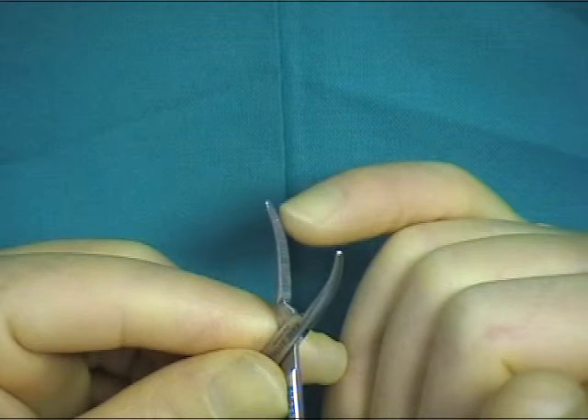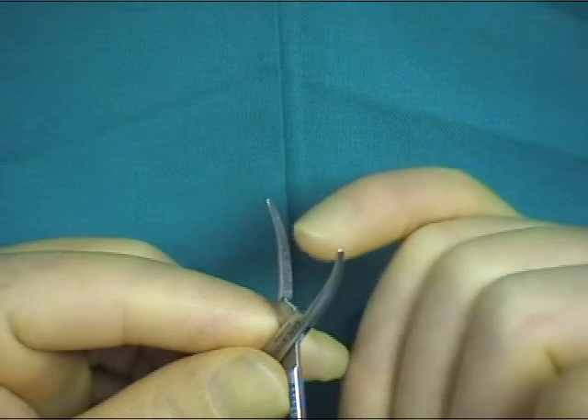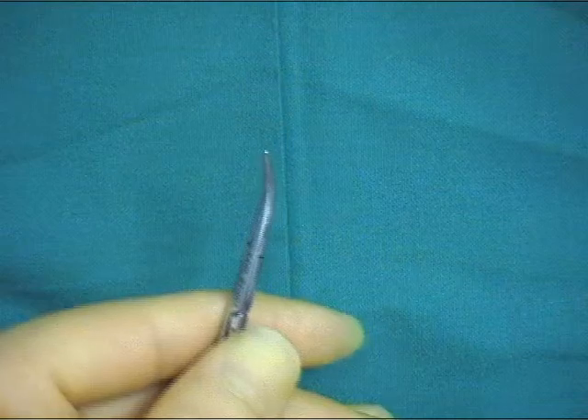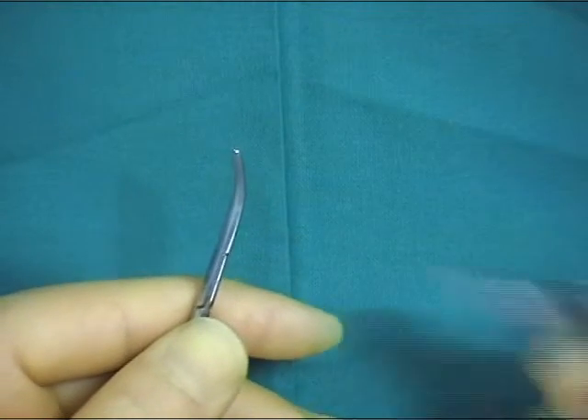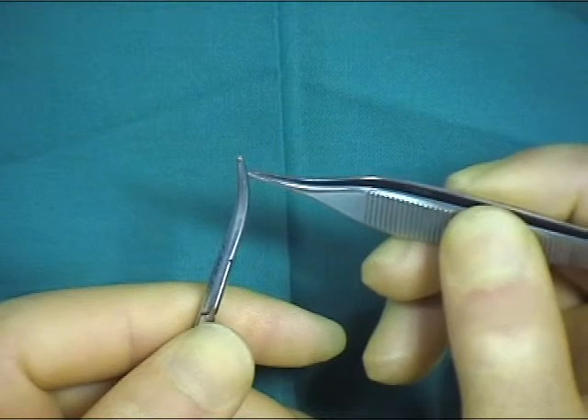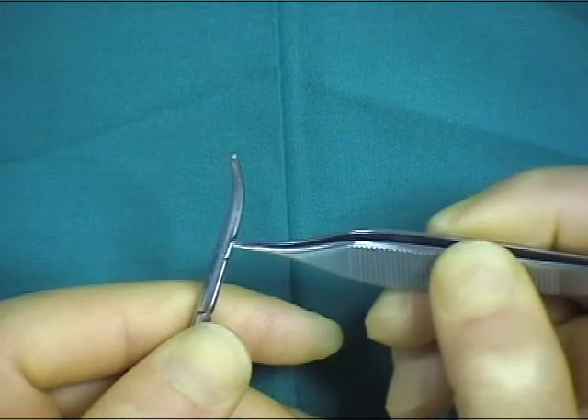When using these instruments, you should not grasp tissue at the very tip of the hemostat but rather slightly proximal to the tip. This allows suture material to be readily passed around the tip of the hemostat for subsequent ligation of the structure.